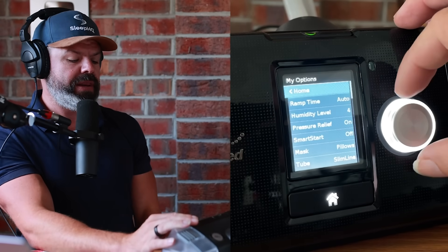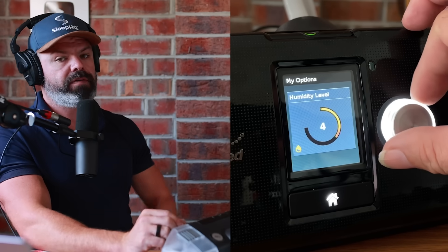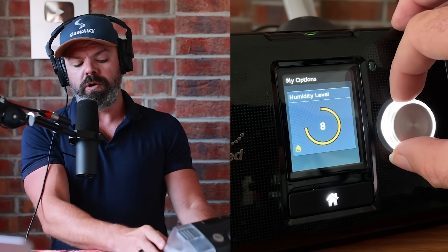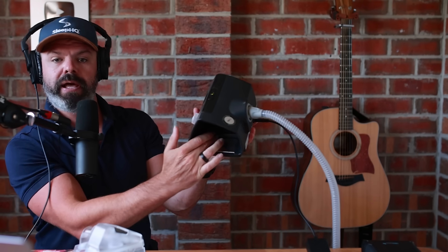My options. So we're going to my options here. Humidity level is currently set to four. And with this machine, we can have off — so no humidity — right up to level eight. What's happening there is a little water chamber here has a metal plate, and that sits on a heater plate in here. As we're increasing the humidity level, it's increasing the heat on the plate. The water turns to vapor — the higher the temperature of the plate, the more vapor, the more humidity.